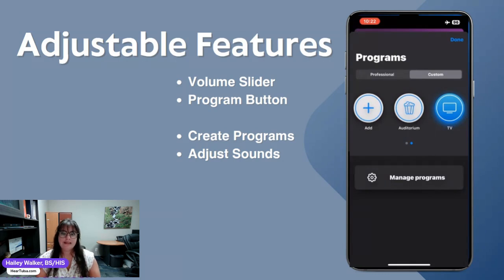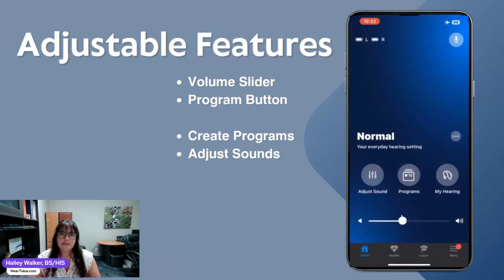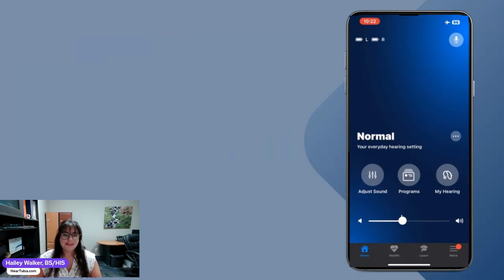as I need. And now that TV is going to be in our custom menu, or kind of a quick swap. You can hit that last custom button, and then you can switch back and forth between your normal programming and your own custom one that you were last at.